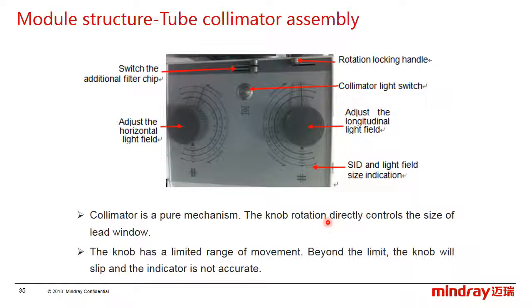Another important structure is the collimator. The collimator is an outsourcing component, and the model is CX03, which is a totally manual collimator.